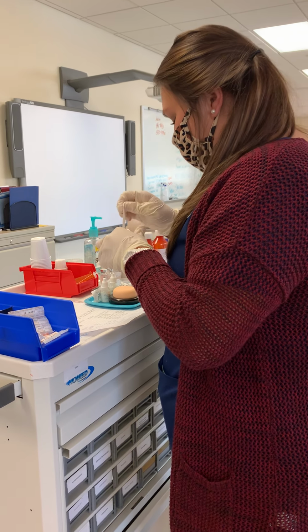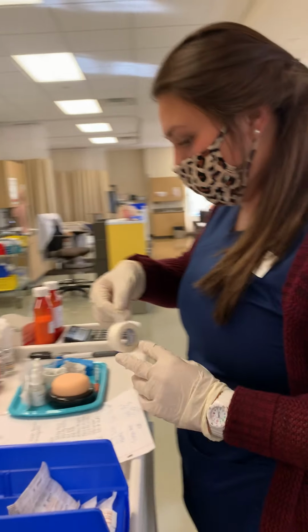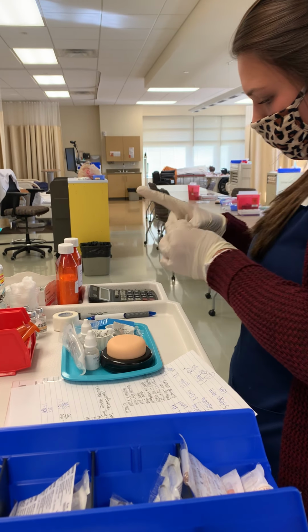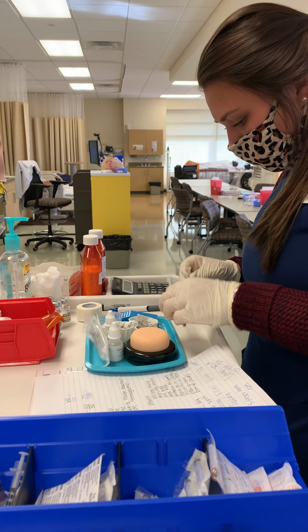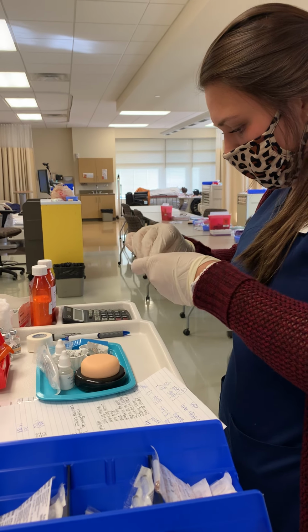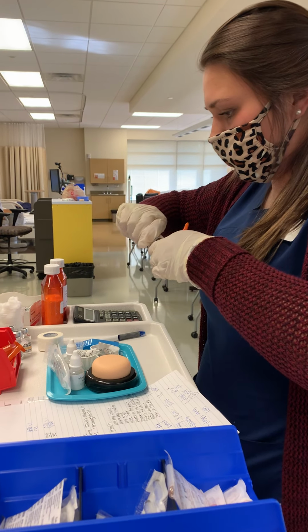I'm going to label my injections. One's insulin, and all right, this is my insulin.